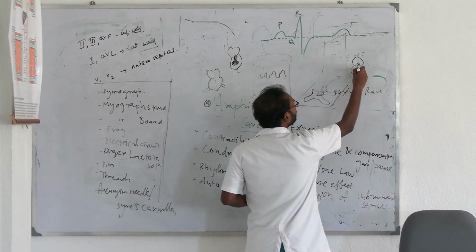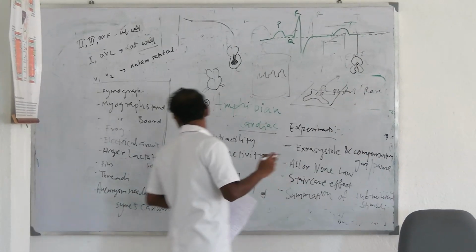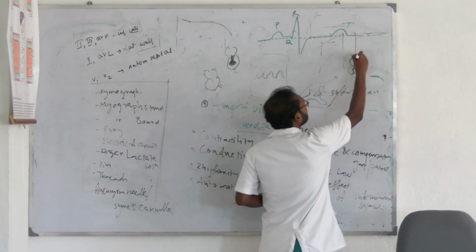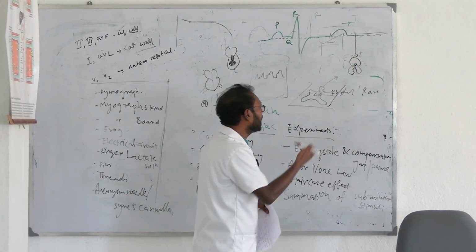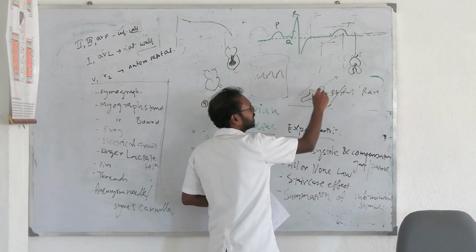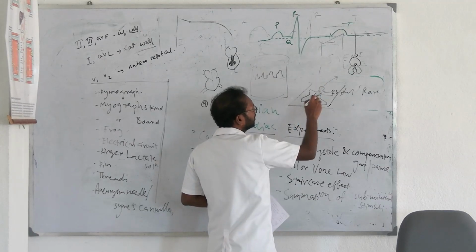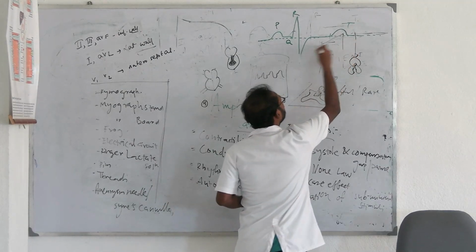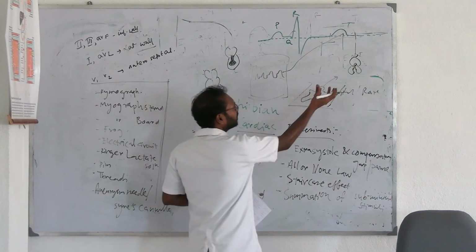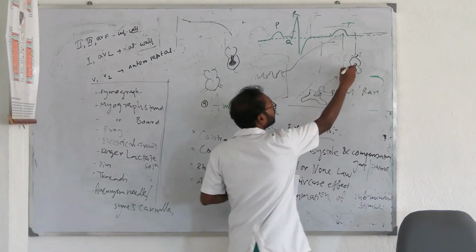It is placed upside down and suspended via the pins and threads, we hang it like this. It is suspended but not detached from the frog body. It is slightly suspended and the other part of the pin is on the board, so that whenever the heart contracts, I will explain how. Now suppose this is the frog, and the heart is here.